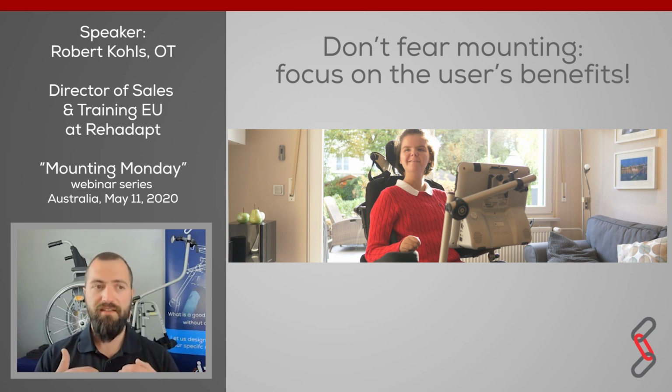And if you understand your customer and your customer's situation, you know now there are light mounts, there are short mounts, there are curved mounts, there are HD mounts. Understand the wheelchair, look at how the wheelchair is working, look for the right frame clamp construction, and check what are distracting elements on the wheelchair that can have a negative influence on using it.